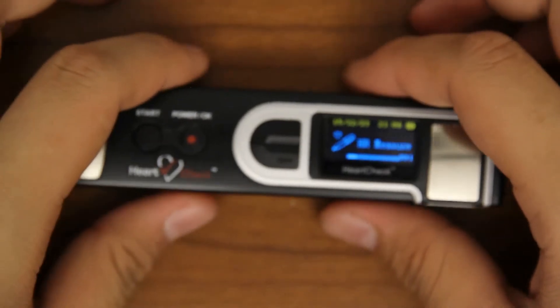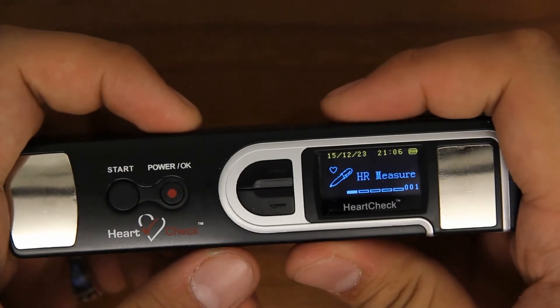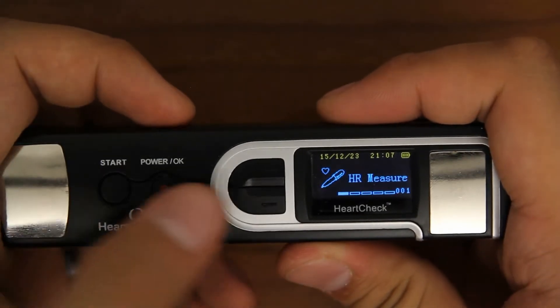Deleting ECGs. The HeartCheck Pen device can store up to 20 ECGs. To clear ECGs from your device, scroll to and select the Delete Data category.